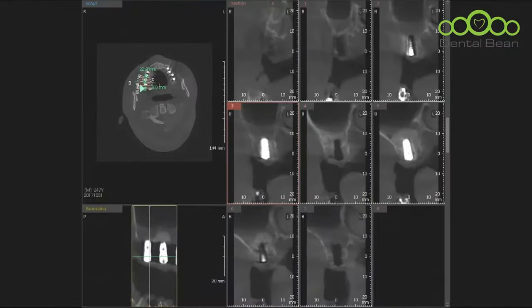Yeah. CT, okay, our CT is ready then. Okay, let's show you the CT. Okay, this is the right molar site, 6 and 7. For 7 I didn't graft it, but the height looks not bad. Number 6 looks well done. As you see, nice membrane elevation, including the medial sinus wall. It's fantastic. And then the bone graft looks sufficient, although it is not important.